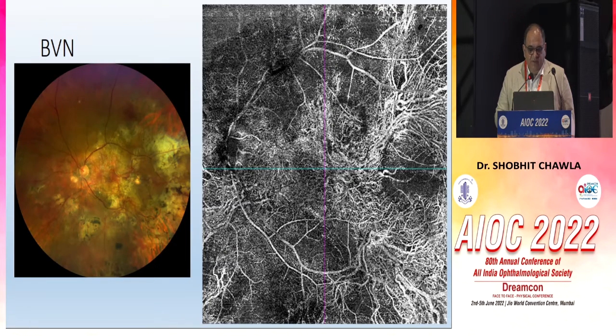You see the same patient showing similar lesions, and you can see on a wide field OCTA image the branching vascular networks almost looking like a bush, but the vessels are mature, and these patients tend not to bleed later once the branching vascular network matures.